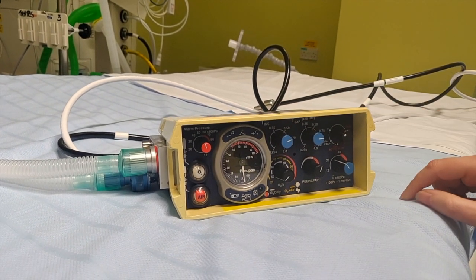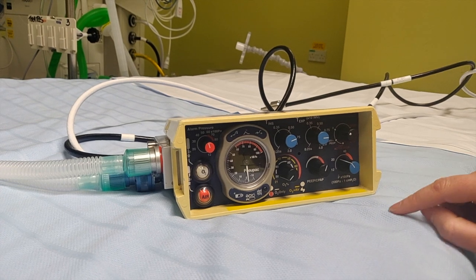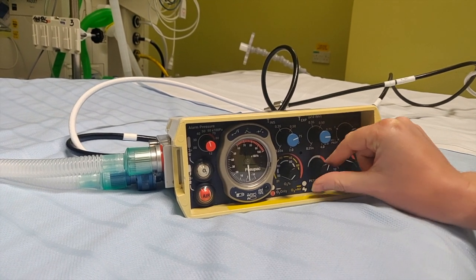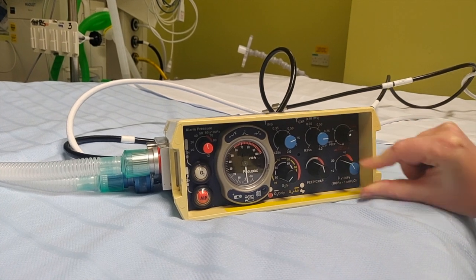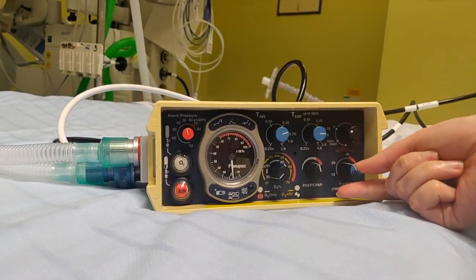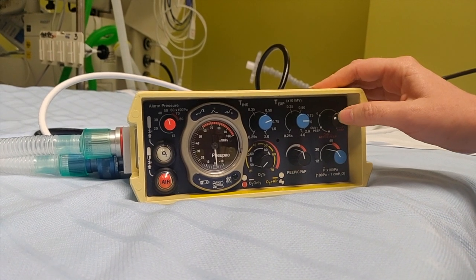What else do we need to set up? We need to set up the two pressures: the PEEP and the peak pressure. The PEEP is this dial here, and this one will be the peak pressure. We're going to have to adapt these when we connect the ventilator. And here to turn it on, we have the different modes.